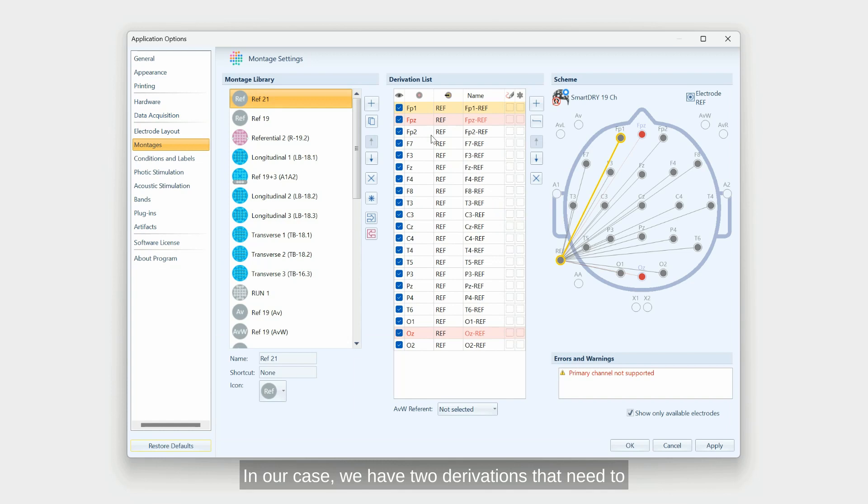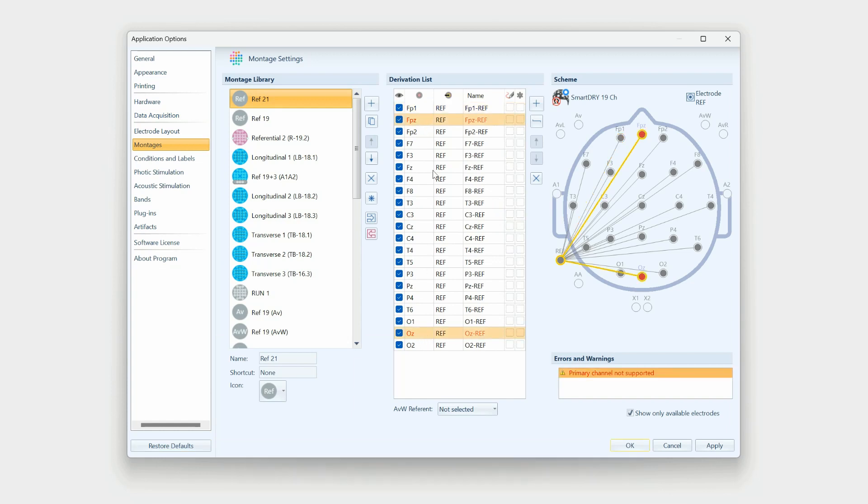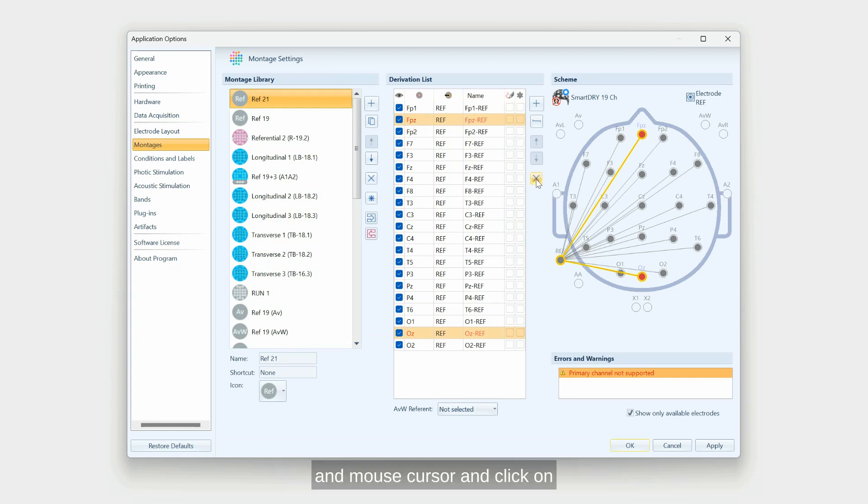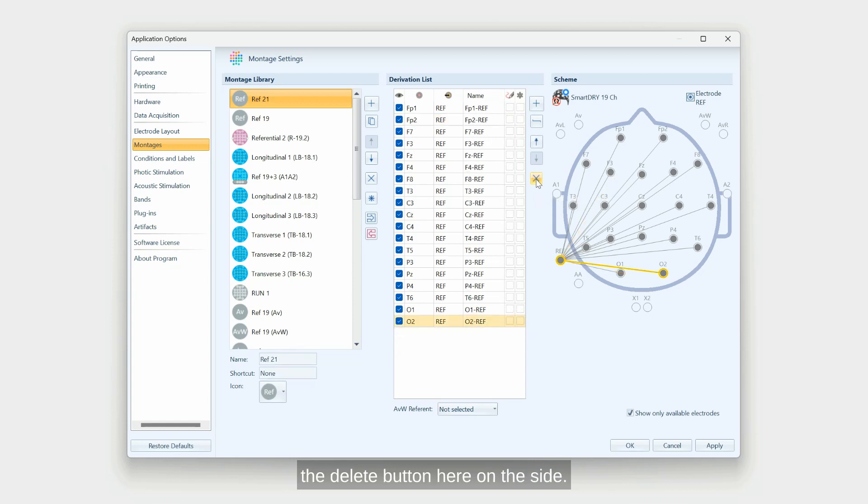In our case, we have two derivations that need to be deleted as the SmartDryCap doesn't have them. Simply select FPZ and OZ using Control and mouse cursor and click on the delete button here on the side.